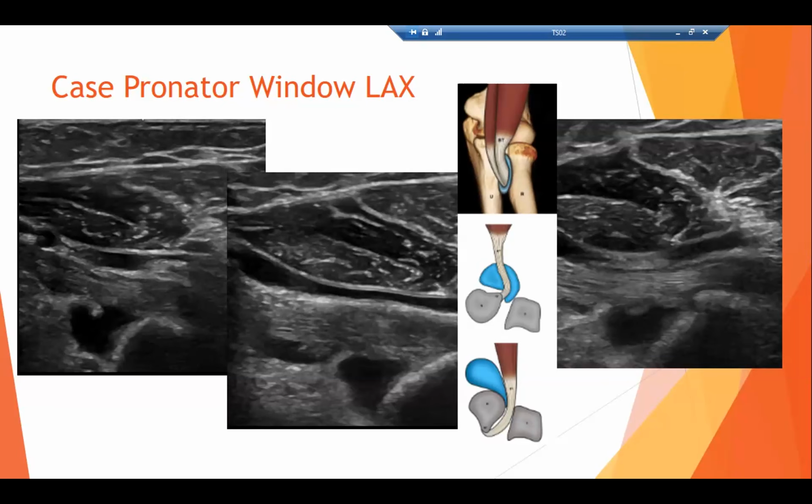But the thing I like about that home base in reference to the distal biceps is oftentimes you see the pathology right away on that short axis. So when I'm at that home base, the first thing I do is scan proximally until I see that central tendon in the biceps, and I can tell right away if there's a rupture or not. Then as you get back to the home base and start to scan distally, oftentimes you can see the biceps pathology if it's not ruptured, but you have partial tearing or tendinosis. So I'm with you on that, and I love that home base.